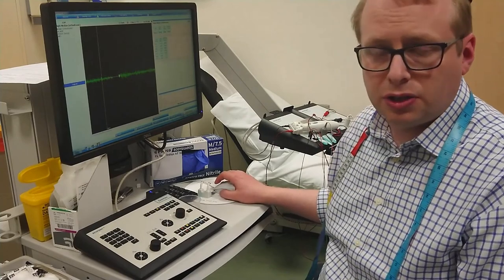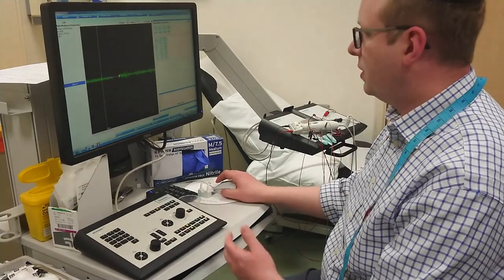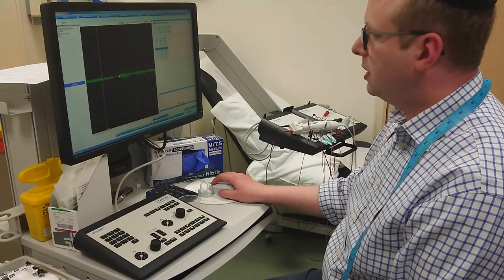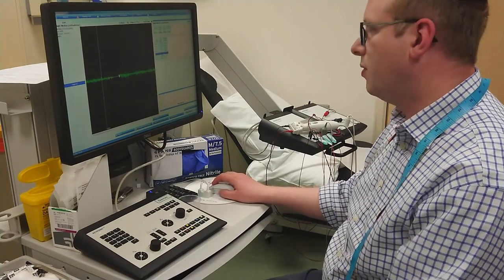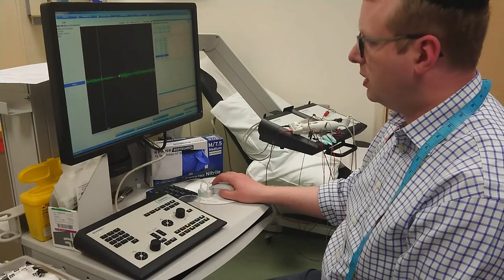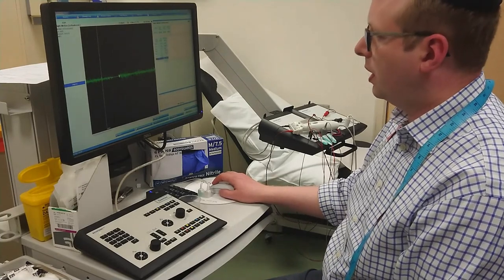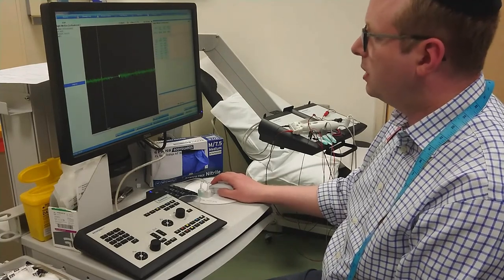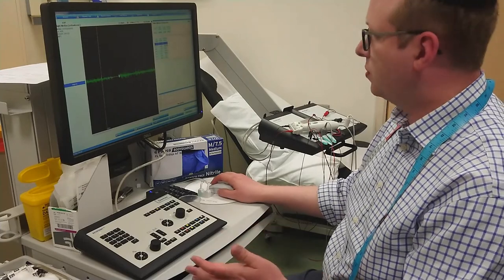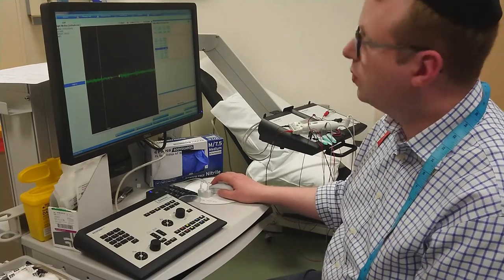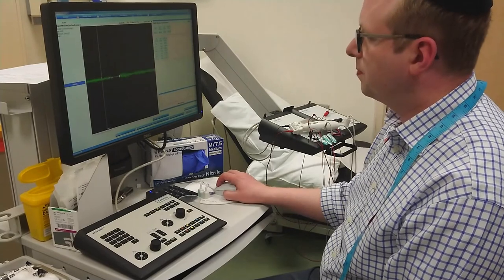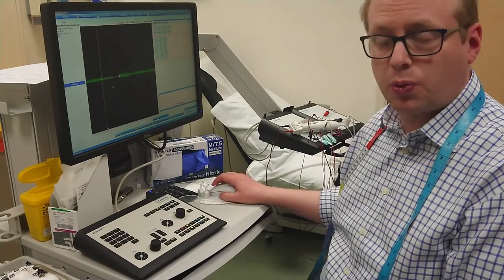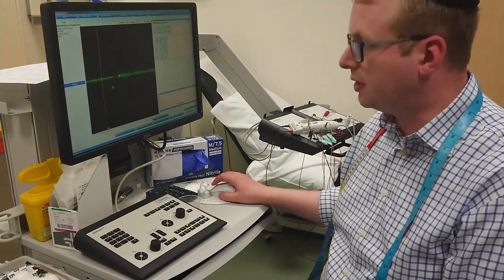And you can use the marker system here very easily to determine the latency of start and, of course, the latency of offset of the cutaneous silent period and work out the latency in between, either by shortest one or an average or however you wish to calculate it. So that's how you do it and that's what the end point of all of this is.